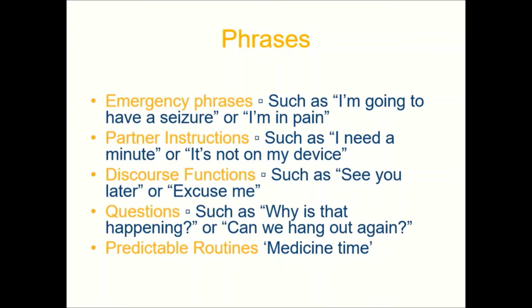Some of your clients will feel it's really important for them to have social greetings on there. Some of our clients love to say please and thank you. They love to say good morning. They want to ask how we're doing. So you can add those onto the chart. And similarly with questions, there might be important questions they want to ask regularly. What's for lunch today? Or is so and so visiting today? So you can generate these phrases together with your client and you can prioritize them and see how much space you've got on your letter chart to add them.